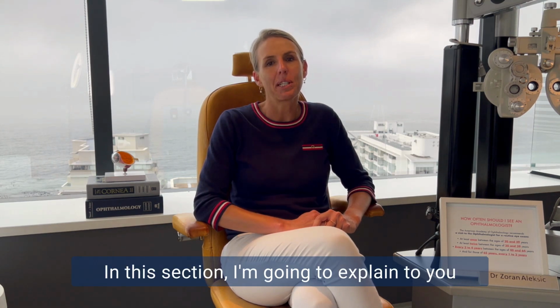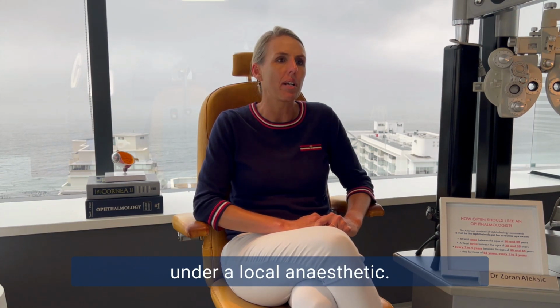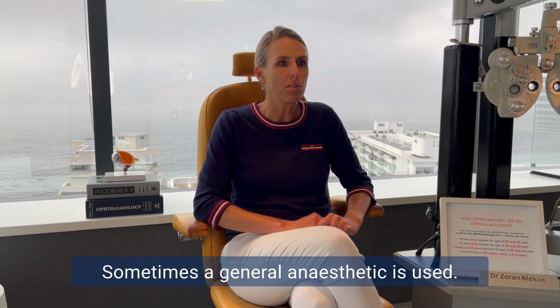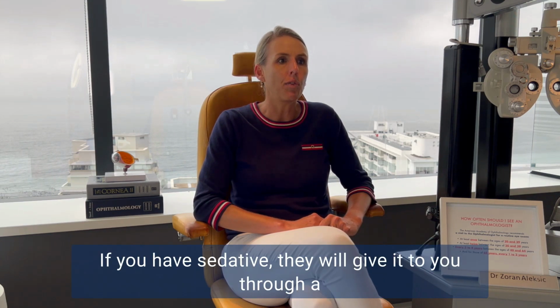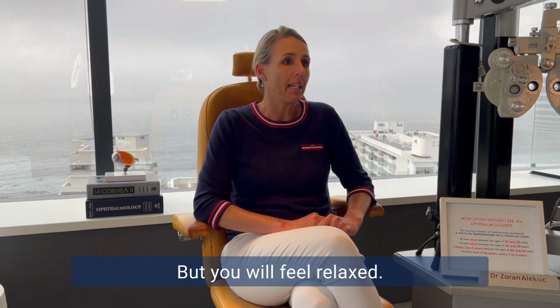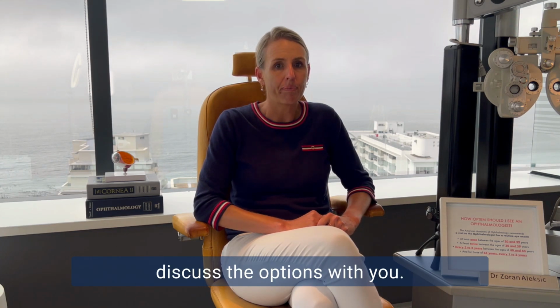In this section, I'm going to explain to you what happens in the actual operating theatre. The operation is usually performed under a local anesthetic given as eye drops or injected around the eye. Sometimes a general anesthetic is used, or your anaesthetist may offer you a sedative to help you relax. If you have a sedative, they will give it to you through a small needle in your arm or the back of your hand. You will be able to ask and answer questions, but you will feel relaxed. Your anaesthetist or surgeon will discuss the options with you.